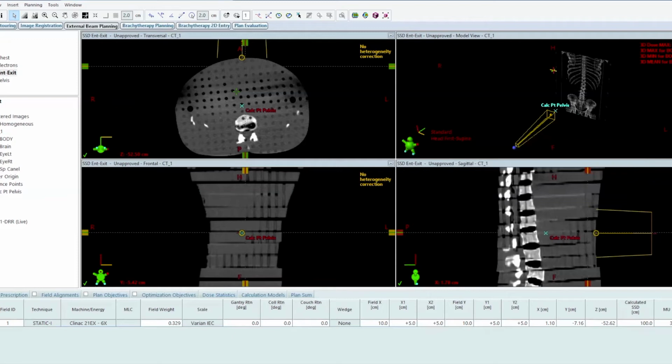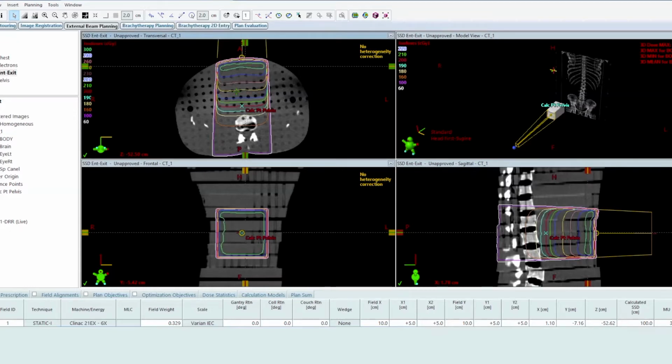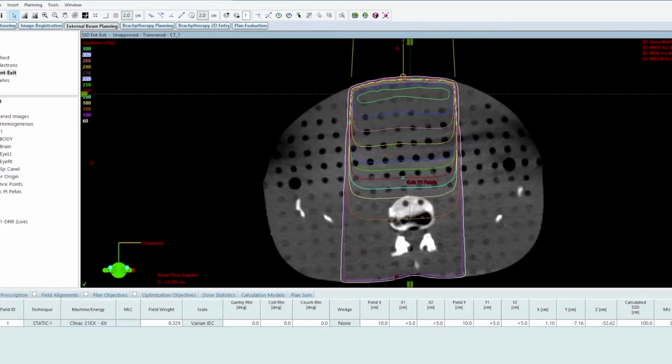We're not going to get lost in the details here. I'm certainly within 1%. Some things to explain this could be the slight curvature of the phantom surface on either the top or the bottom. Regardless, what I'm left with is a dose distribution that looks something like this. Let me blow this up in the axial plane. So I just put a number of different isodose lines on. You can see here on the left-hand side of the page, I've gone from 300 centigray down to 60 centigray. You can see that we essentially have 100 centigray that goes all the way through the patient regardless.